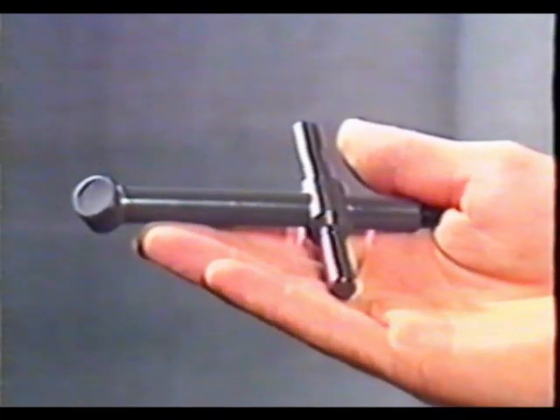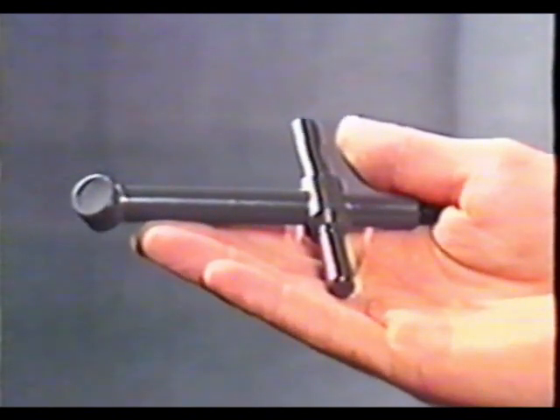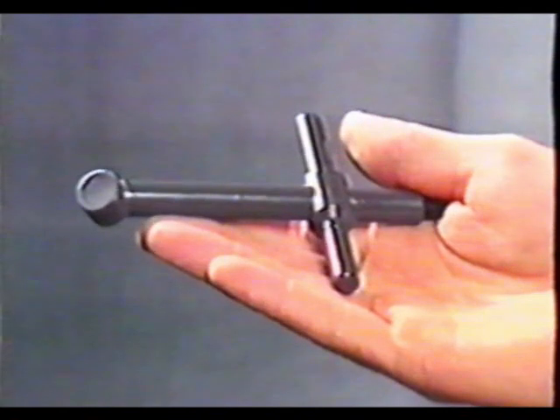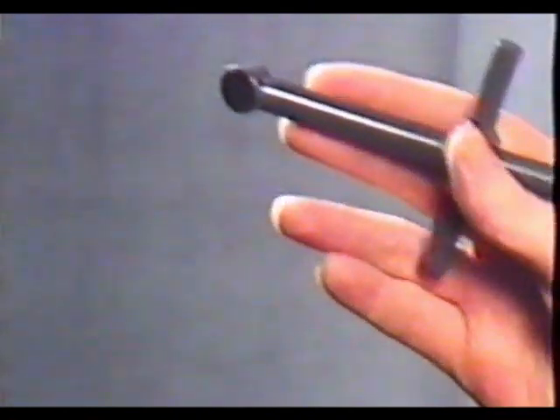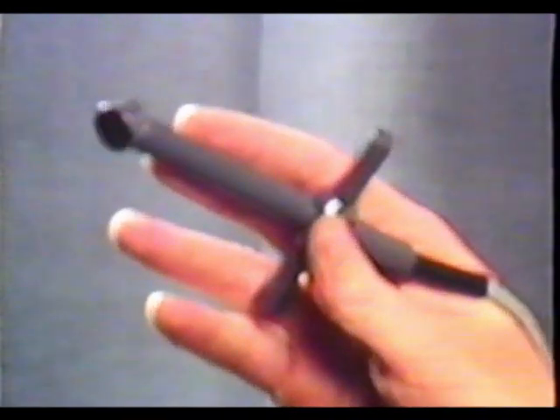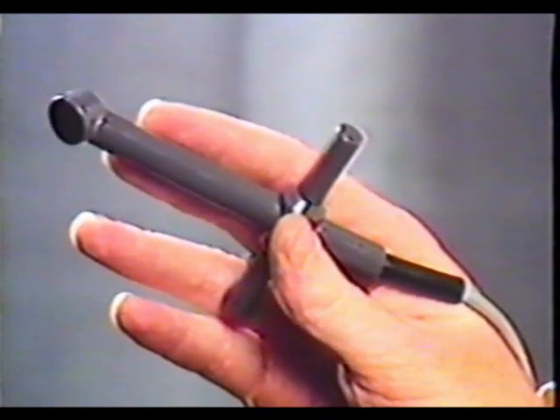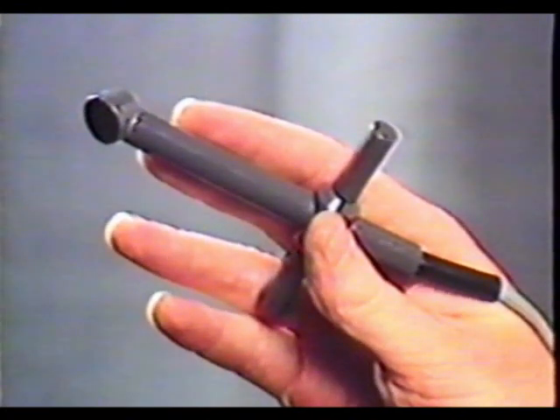The Doppler exam can also be performed without 2D guidance, using a non-imaging transducer. The examiner is then guided by the Doppler spectral display on the screen and by the Doppler audio signals. The non-imaging transducer is quite small. Its tip is designed to fit nicely into the intercostal spaces and into the suprasternal notch. The examiner is therefore often able to achieve angulations of the Doppler beam that are not possible with the bulkier 2D transducer.